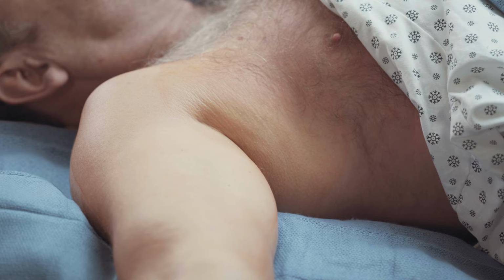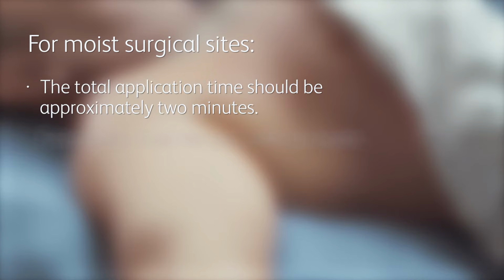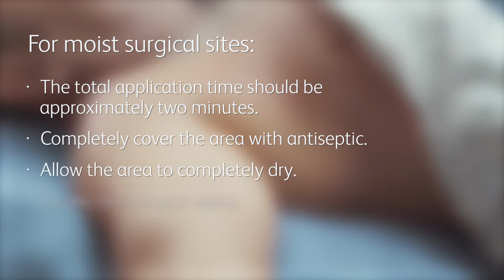For moist surgical sites, such as the axilla or inguinal fold, use gentle, repeated back and forth strokes of the sponge for approximately 2 minutes. After you have completely wet the treatment area with antiseptic, allow the solution to completely dry.